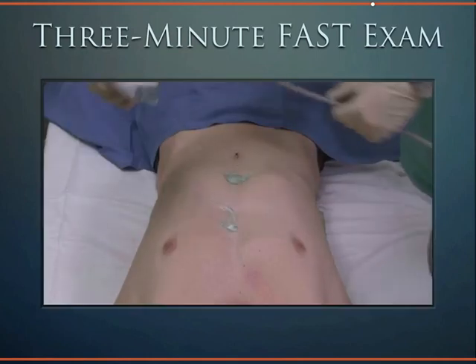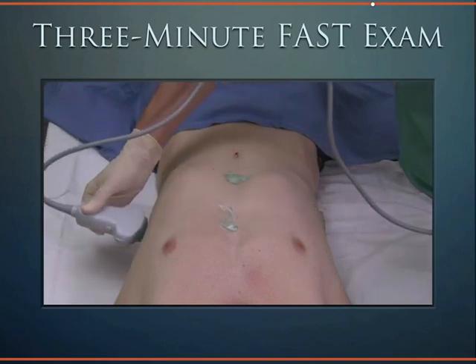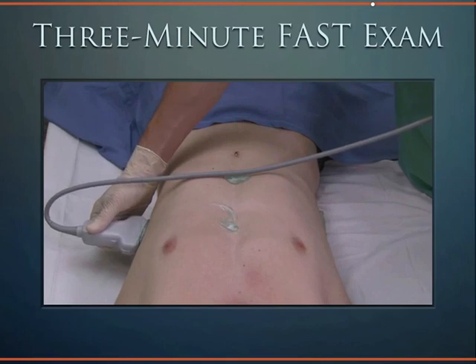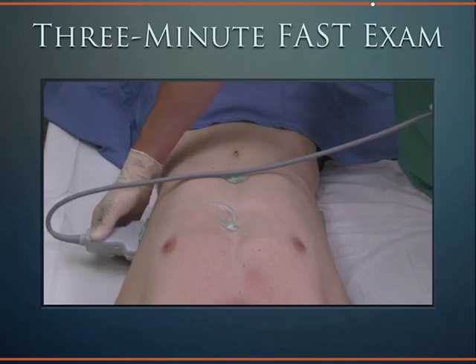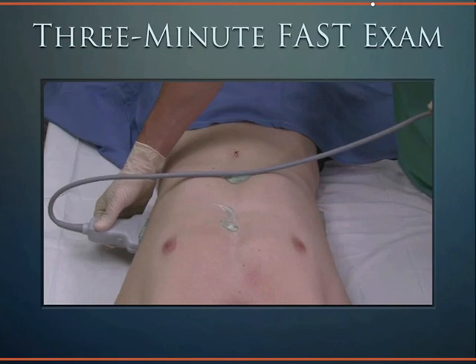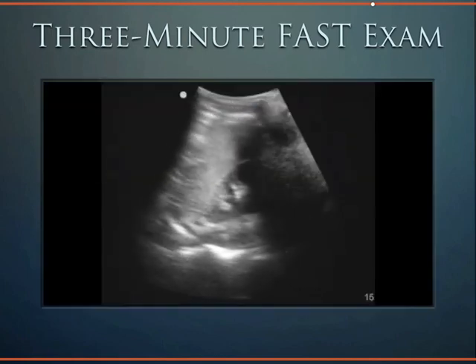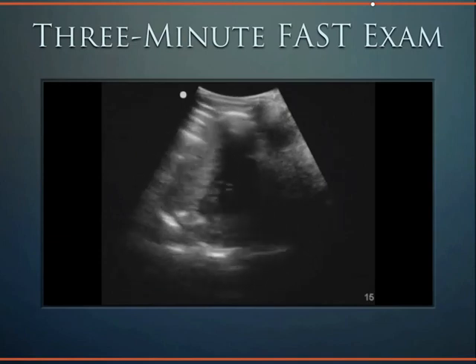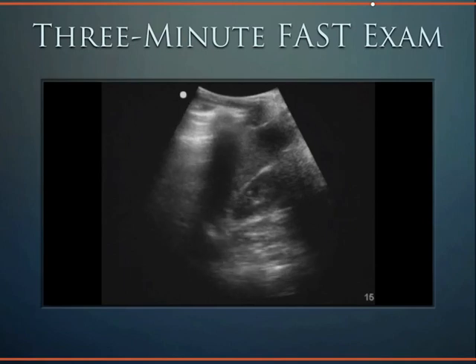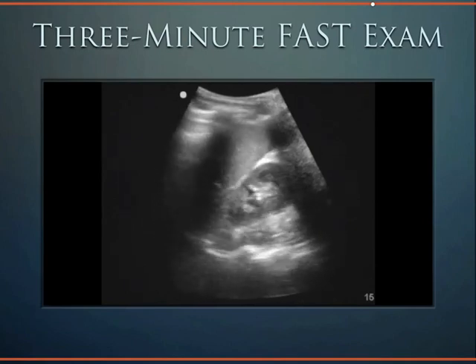The next window of the FAST exam involves the splenorenal view. With the indicator towards the patient's head, position the transducer over the 10th intercostal space, midaxillary. Slide superiorly and inferiorly to get the entire contents of the splenorenal window into view, and fan anteriorly and posteriorly to get the optimal window. Recall that the stomach lies anterior to the spleen.